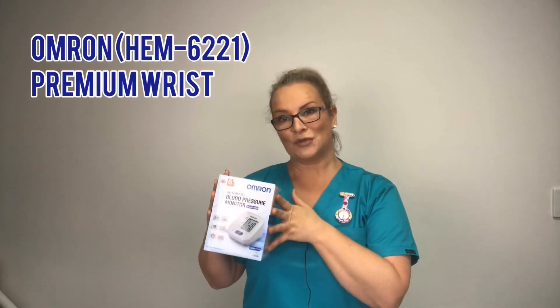A lot of hospitals will use the digital — it makes it nice and easy. As long as you apply the cuff correctly, all you have to do is hit start and your blood pressure readout will be there for you. There's always going to be a time where you need to double-check that reading, so you need to know how to do a manual blood pressure.